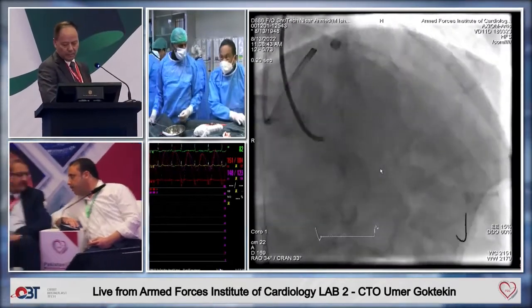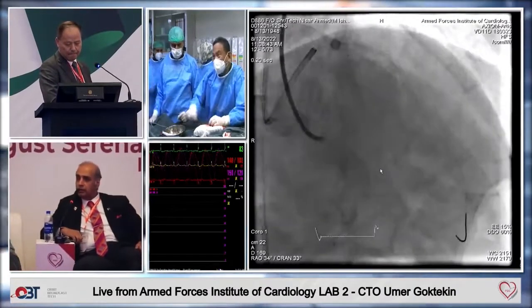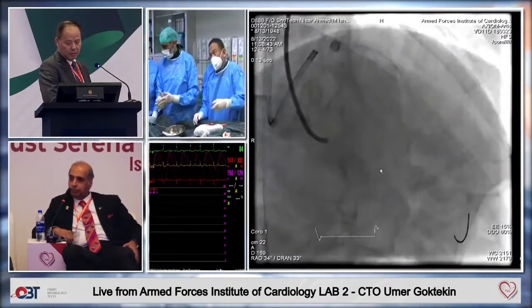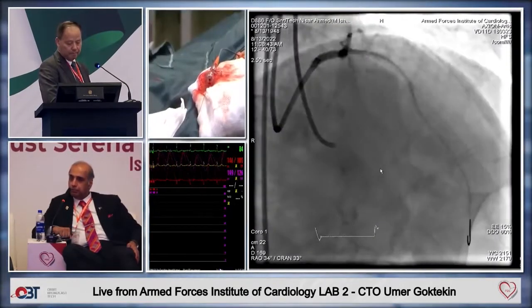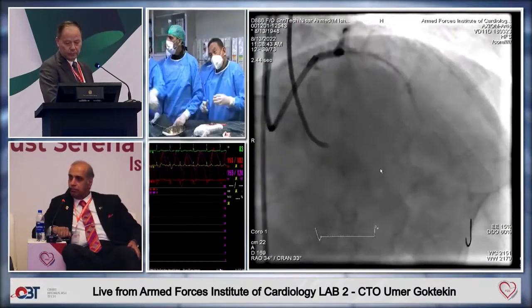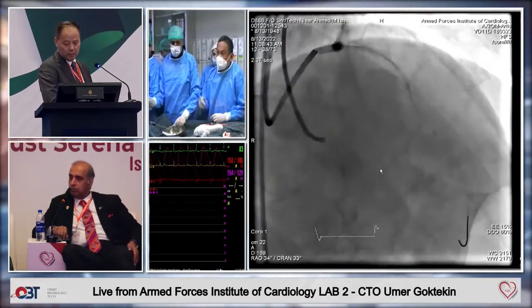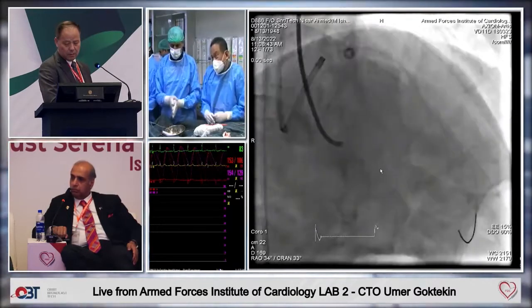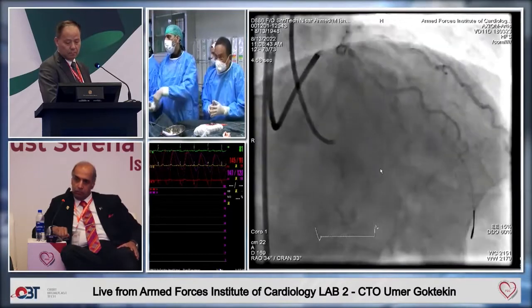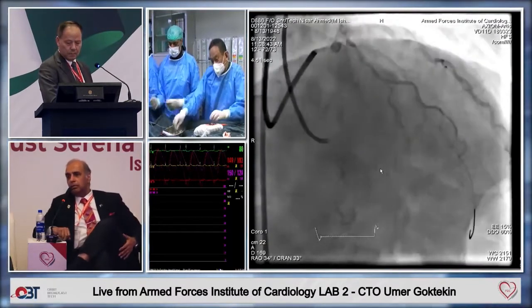No. Rosalie, there's a question over here: would you do an IVUS study of this before deploying anything, to establish the left main? Obviously. So we're going to open up an IVUS because we need to see the stent, whether it's the nose or otherwise. Because if it's in-stent restenosis, then we're going to use a drug-coated balloon and then most likely put in the stent until the ostium of the LAD. And I think over here, we're going to see whether we can try to avoid stenting the left main, if we have some distance and if the left main is not diseased.